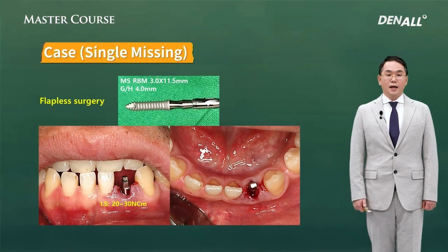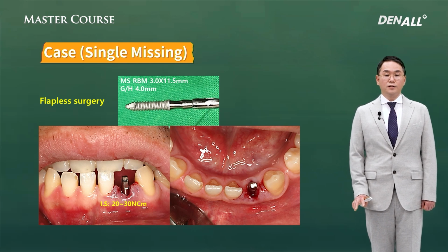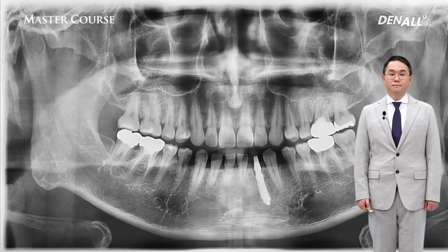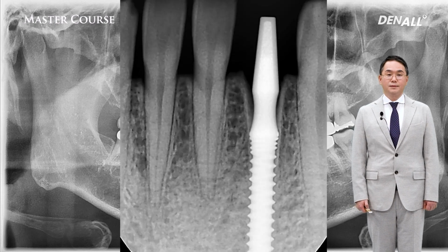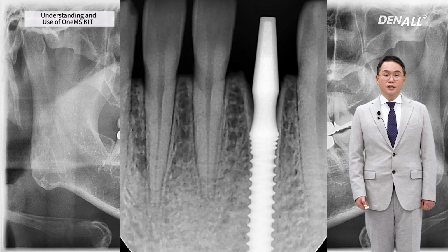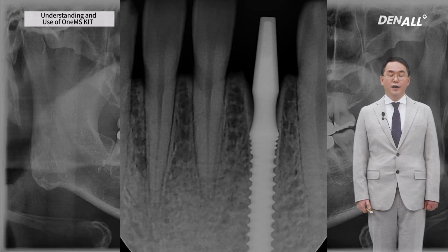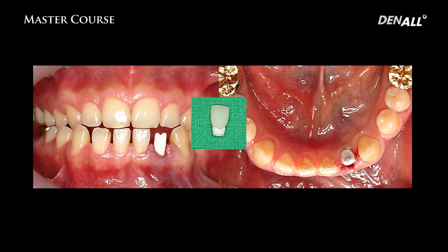Carefully, the root rest is removed, and an MS implant is placed. This is a one-body implant, therefore there is no need to prepare the prosthetic compartment separately. This is the post-op panorama and PA. The roots of the adjacent teeth are not damaged. A provisional cap is connected for provisional restoration, and a temporary crown is bonded over it.